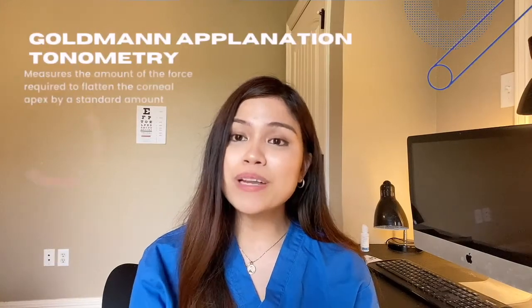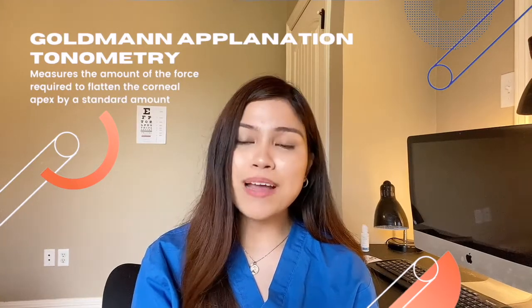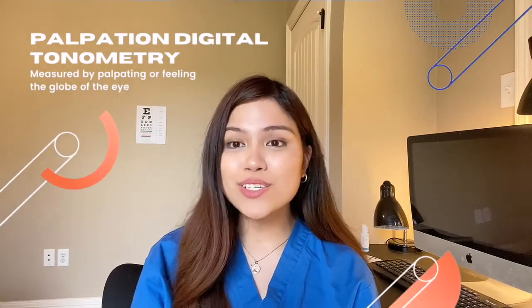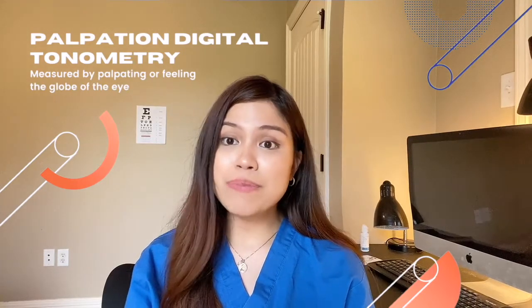Second is the Goldmann applanation tonometry, which measures the amount of force that is required to flatten the corneal apex at a certain or standard amount. The third one is the palpation digital tonometry, which uses an examiner's hands in order to palpate the globe over the eyelid. It may be either hard, like the forehead, or soft, like the cartilage on your nose.